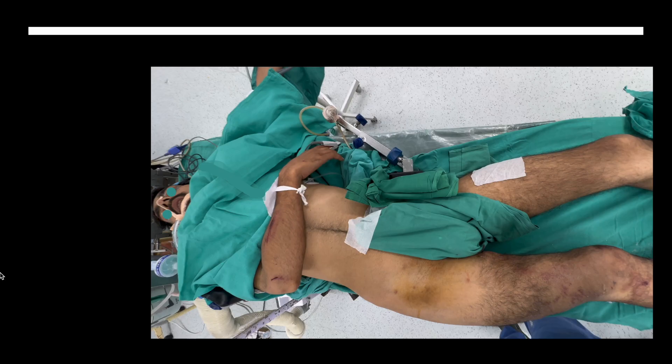First of all, the positioning is critical. You have to keep the patient supine, but the critical part is that you have to place a side support at the level of the contralateral iliac crest, because you have to push the patient towards your side. So if the side being operated is the right side, you place a side support on the left iliac crest. That side support's purpose is to push the pelvis towards the affected side — similar to the fracture table, where we place a bolster in the groin area to curve the patient in a banana-like position.